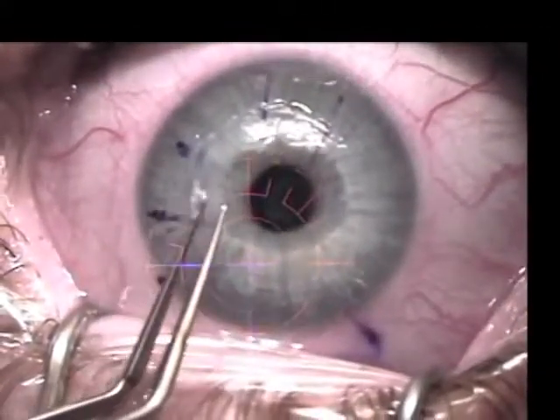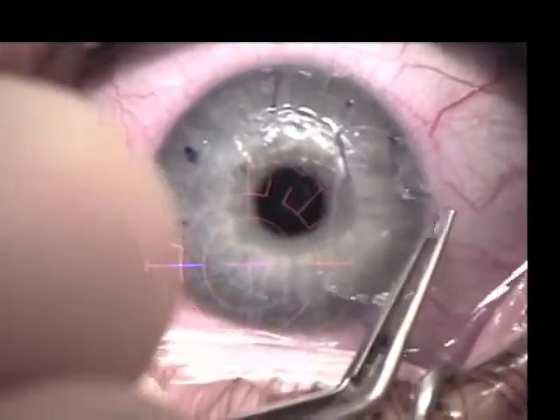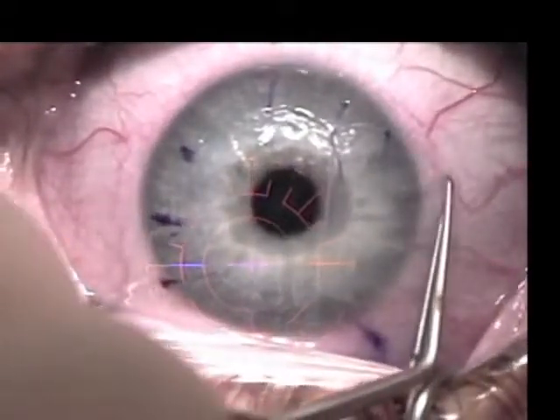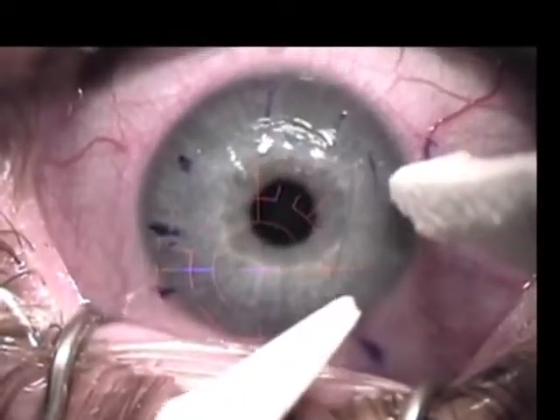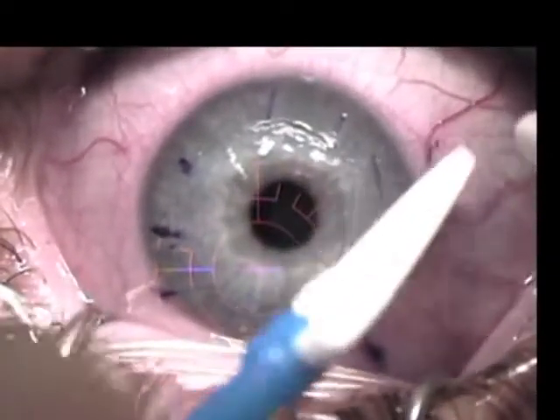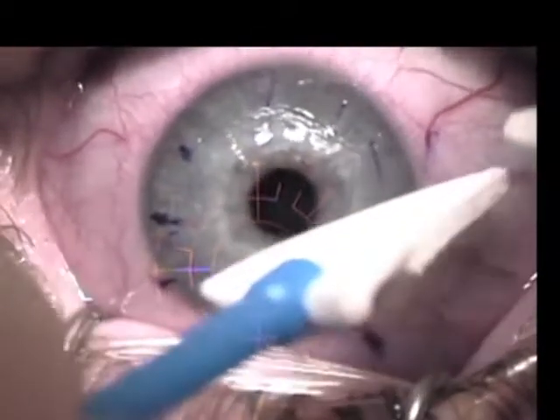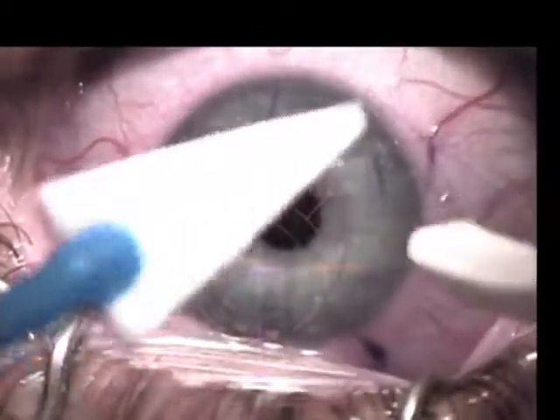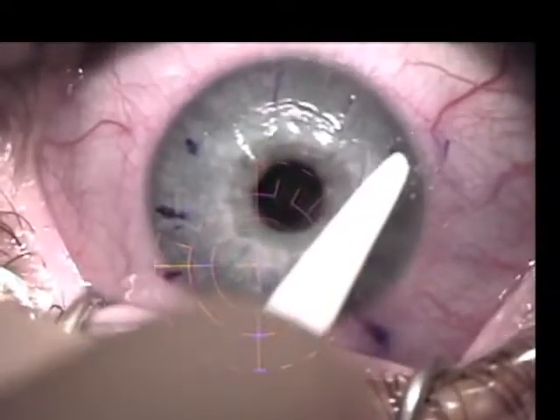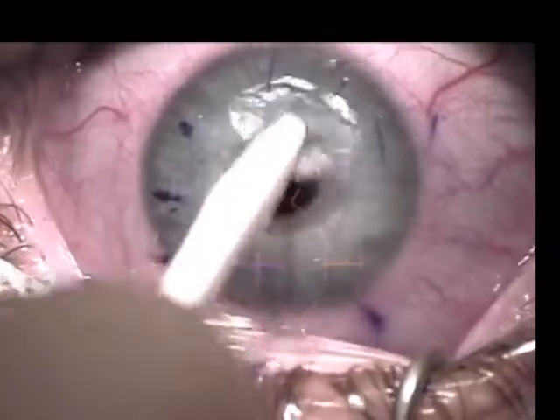A toothless forcep is then used to retract the flap, and lint-free Maricel sponges are used to remove any epithelium on the posterior aspect of the flap. The same process is used to remove epithelium from the stromal bed.